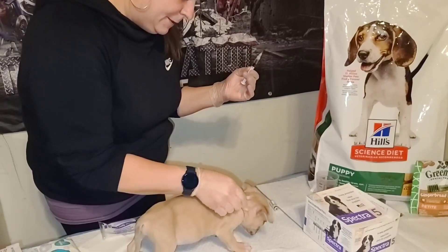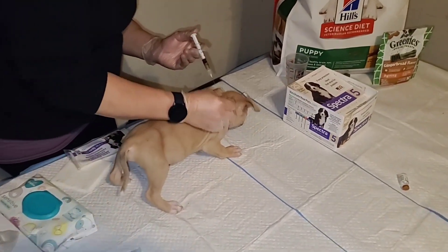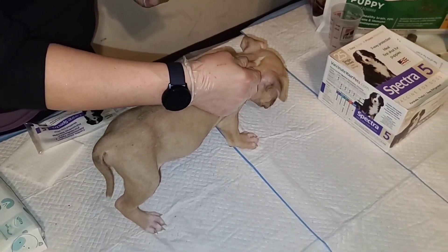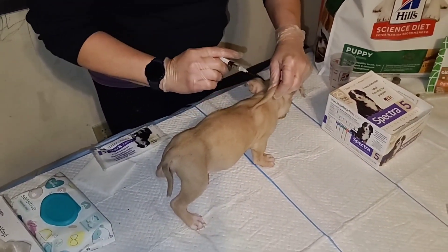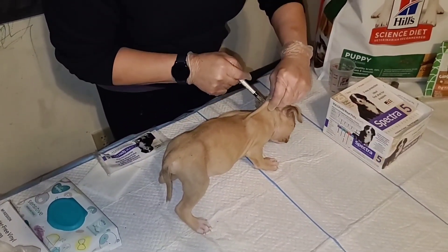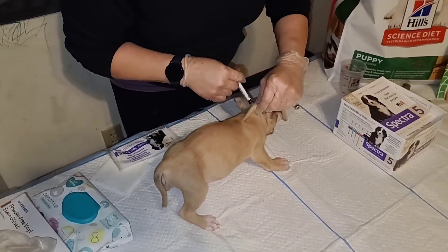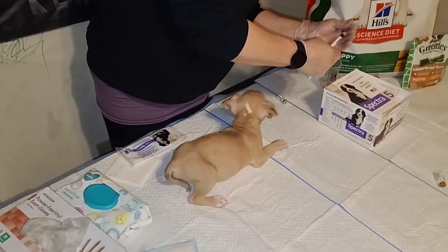For him, we're going to do his injection right here on the back of his neck. Just pull it up like a tent, and once you go in, pull back the plunger to aspirate for blood. If you do get blood back, take it out and pick a new site. If there's no blood, you can continue. No blood — go ahead and administer the vaccine.